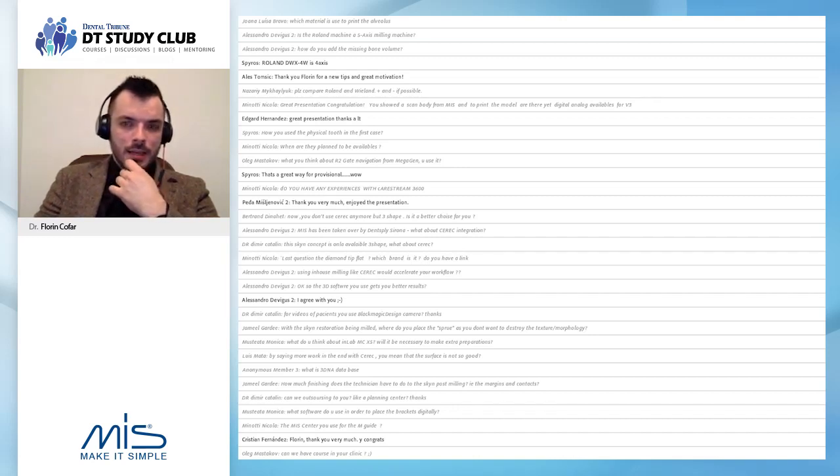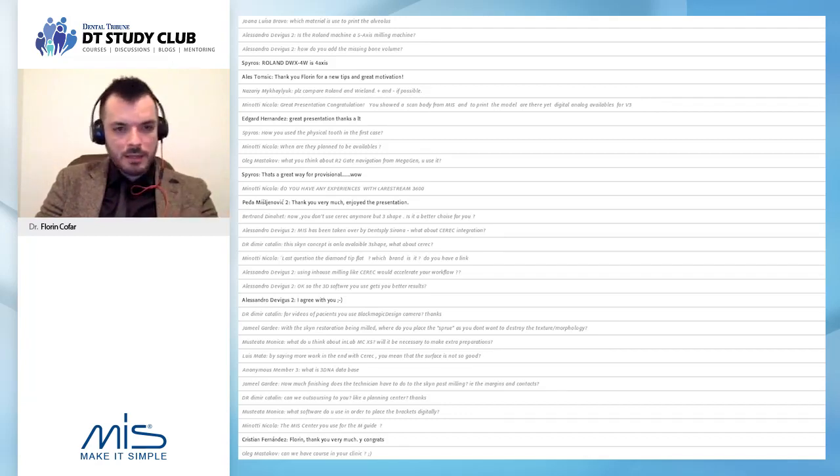Does the 3D software get you better results? Yes, I think the software has a big input in this. Basically, you have three things in CAD/CAM. You have input, which most scanners will work fine. After input, you have the processing of information.